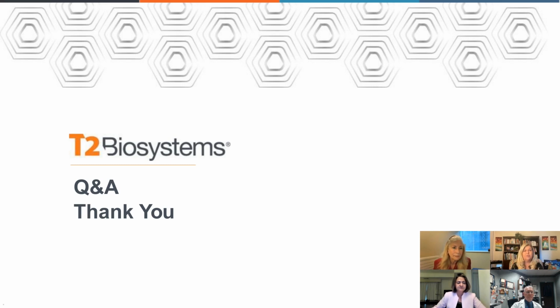Our first question is for you, Dr. Snyder. Are the blood culture instruments located at each hospital or only at UL? Each institution has their own blood culture instrument. However, we're trying to standardize that where we use and select one instrument only. Currently, we're diverse, and that's a direct result of the transition we're undergoing right now. But what they will do is send the positive blood cultures to us for full workup.